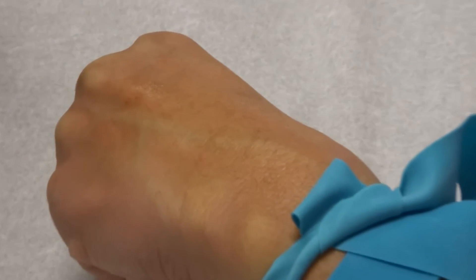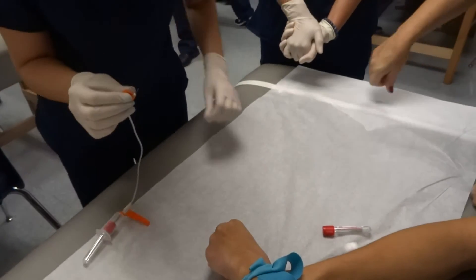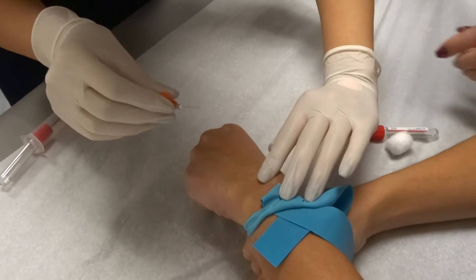You're going to hang on to that circle. Circles together? Yes. So that means bevel up already, right? Bevel up if you've got your circles together. Push down and pull back on that. Good. You've got that, sucker.